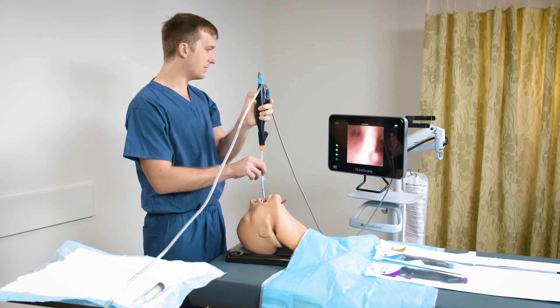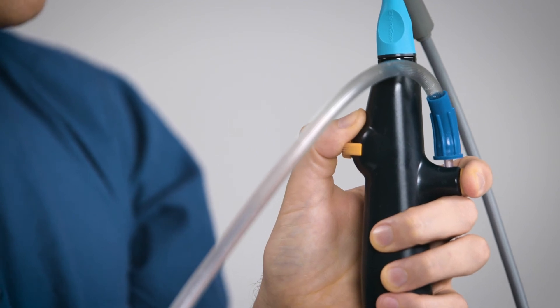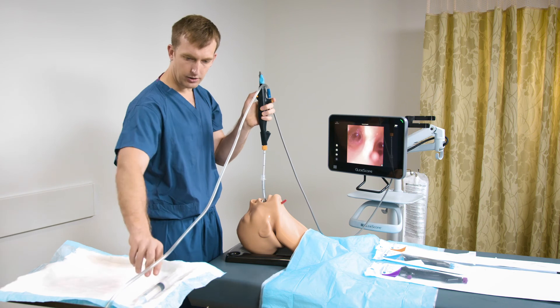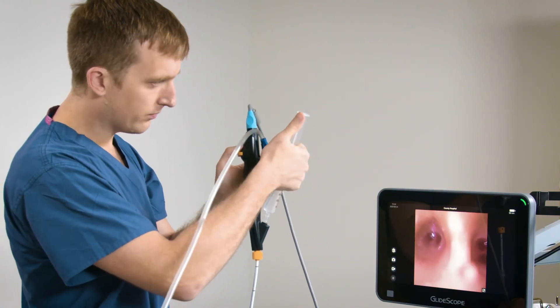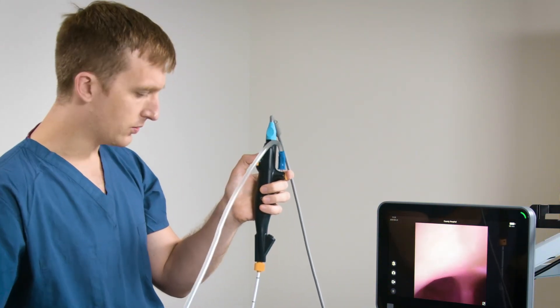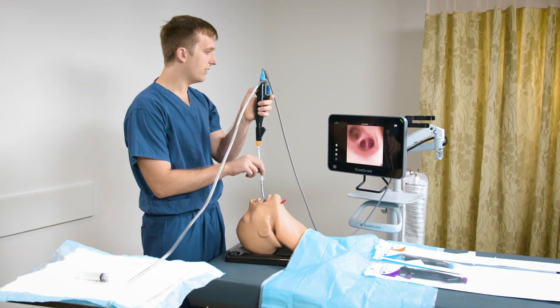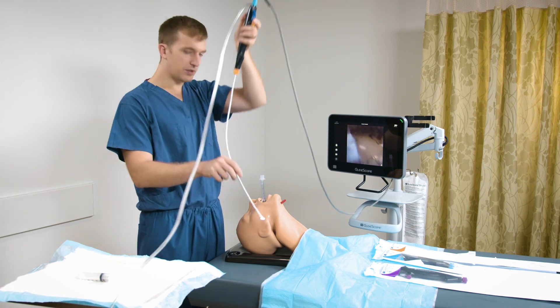Note that to avoid airway collapse, I can use partial suctioning technique. For tenacious secretions, I'll sometimes inject a little bit of fluid, which can be done through the accessory port. Note that when suctioning, I want to make sure that nothing is in the accessory port while actually suctioning. Once I've completed suctioning, I then remove the bronchoscope from the patient and the procedure is complete.